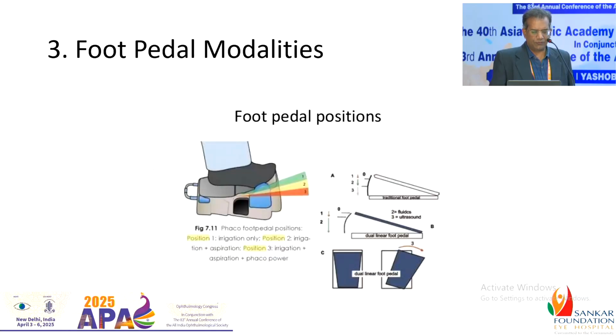So when we spoke, the foot pedal has to be understood. The foot pedal physically can have vertical movement and also the linear movement. Most of the horizontal movement also, but most of us prefer linear movement. But the control is done by the machine console, whether it is set to linear or whether it is set to non-linear mode should be understood.